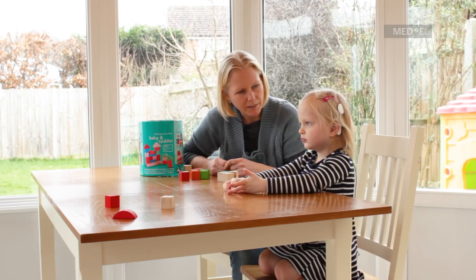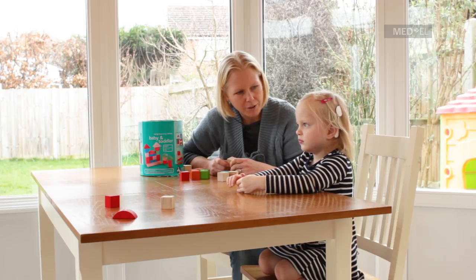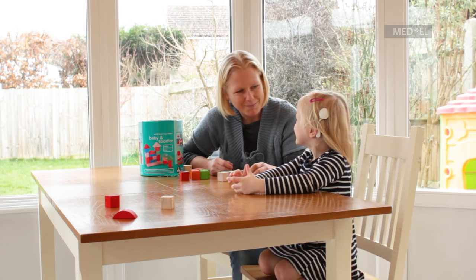So you say the sounds after me, okay? And then when you say the sounds you can put a block on the tower. All right? Ready?